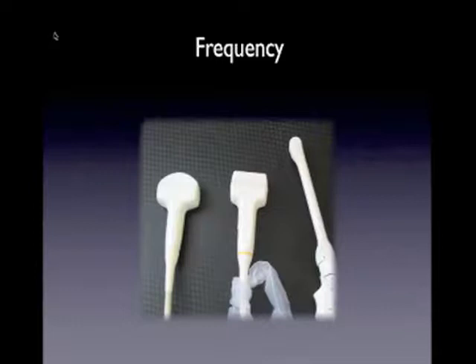The probe on the far right is a high-frequency endocavitary probe with frequencies between 8 to 13 megahertz. It is also excellent for imaging superficial structures. It is used in particular for imaging of pelvic structures and the eye, as well as to assess for peritonsillar abscesses.